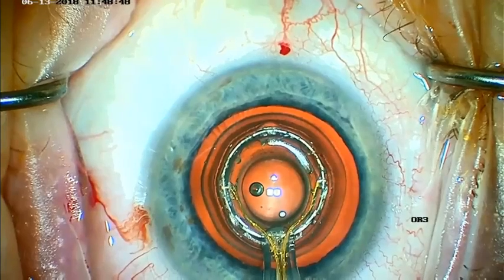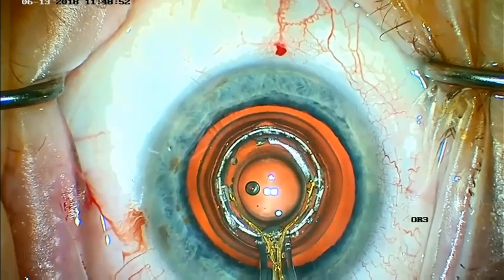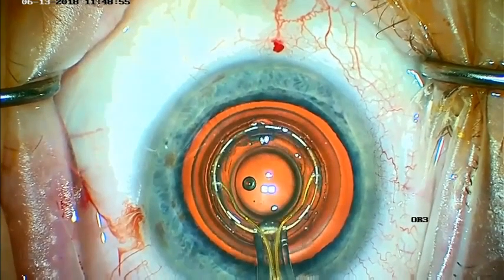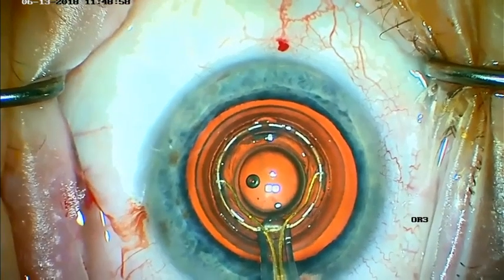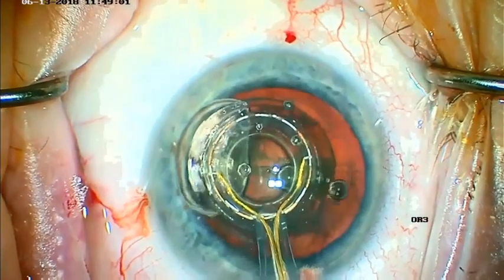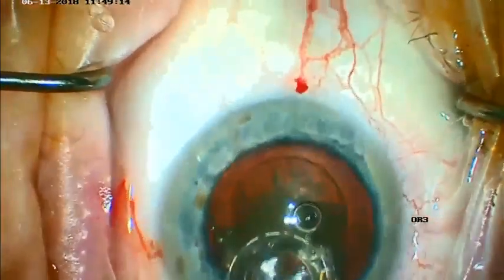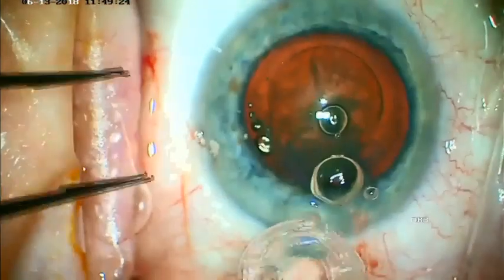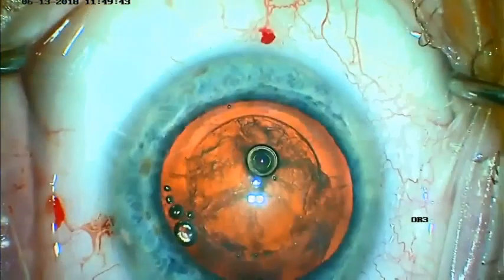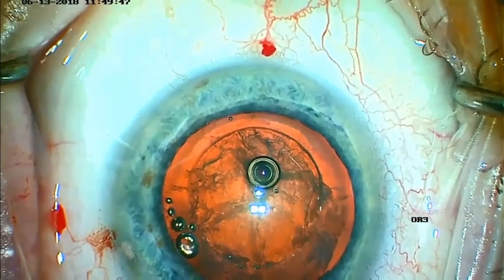Once we reach maximum suction, the bubbles essentially stop flowing. At this point we ask for energy to be applied — there you see it — and this creates the cut. Within one or two seconds, we ask the assistant to release the suction, and the capsulotomy is created. The device is then pulled out, collapses nicely through the main incision, and we can see the nice circular, well-centered capsulotomy.